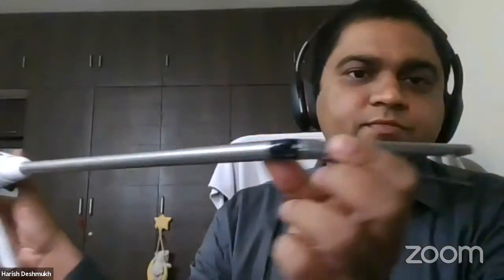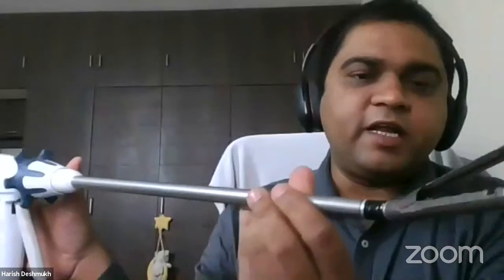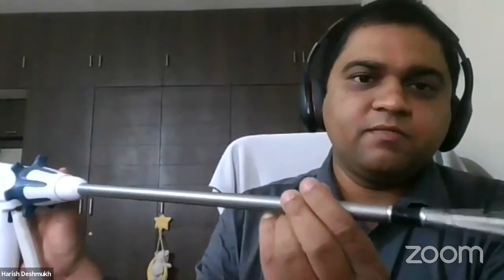If you talk about the distal end from the proximal end of the gun, we have the anvil half, we have the cartridge half, we have two ends. This black color is an articulating joint. It is used to articulate if you require any articulation during the firing. So you can see the articulation here. This can be used for your firing anytime, whatever angle you require to fire.